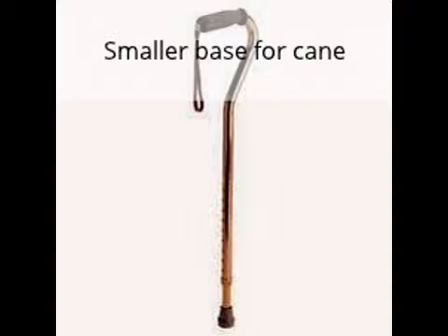One prong, which is one little tip at the end, just helps with basic stability. That's usually where people who have walking difficulties, small fall risk, start to begin to ambulate with.